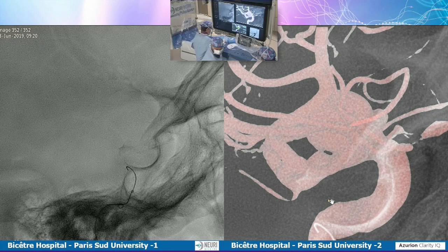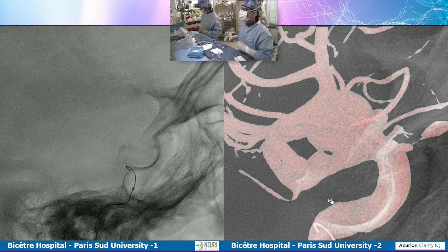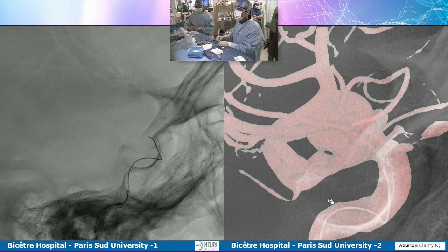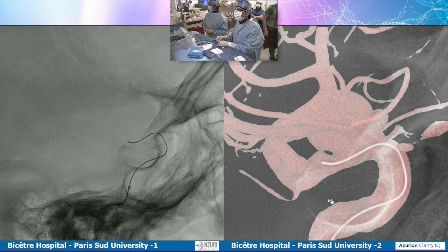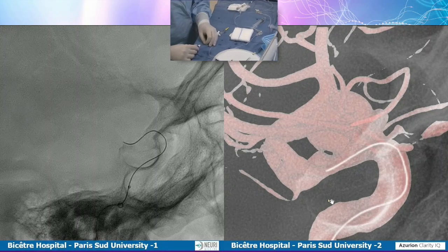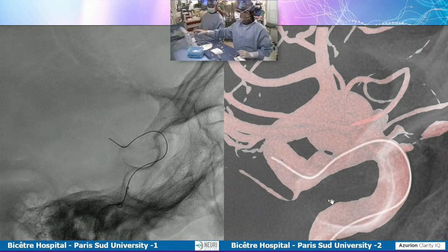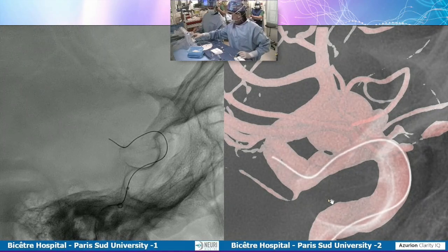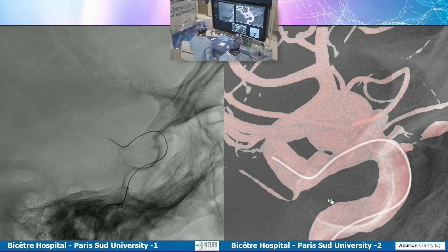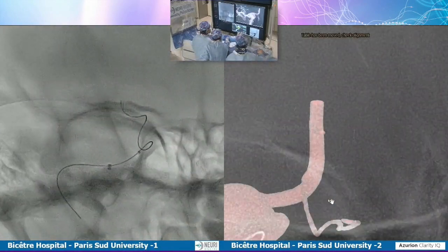Do you ever study the internal maxillary artery to see the ophthalmic filling from the internal maxillary? No, it always exists. A long time ago we did, but now we don't. Okay. No, you do it, Alex. There is no reason to do it. You are not sure you will see something, even if there is an anastomosis. Well, I'm just showing my age. You may have an anastomosis which is not visible because it's coming from the normal direction of flow.